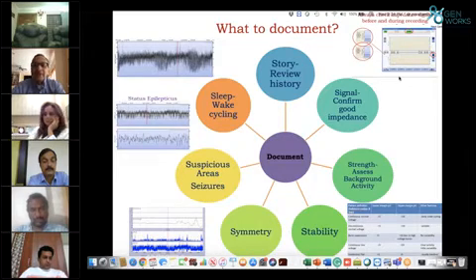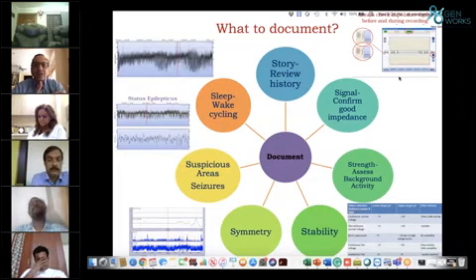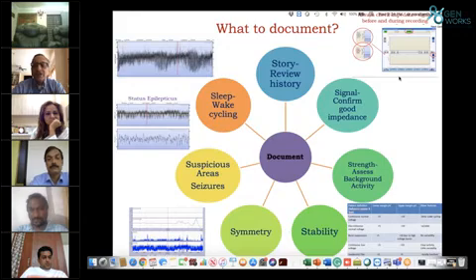Again, these are the predominant pattern over the last 24 hours. If you're doing this once a day, documentation is important. If there are any changes over time, so if the baby was initially continuous with good cyclicity and at midnight suddenly develops a burst suppression pattern, or seizures, then you can actually go back and time that in your documentation.